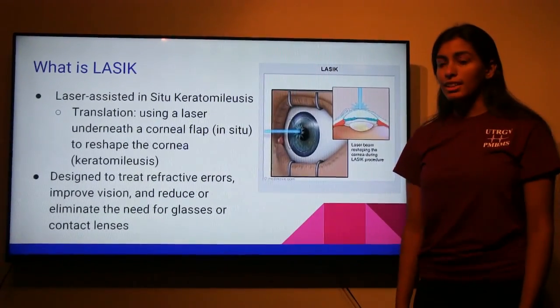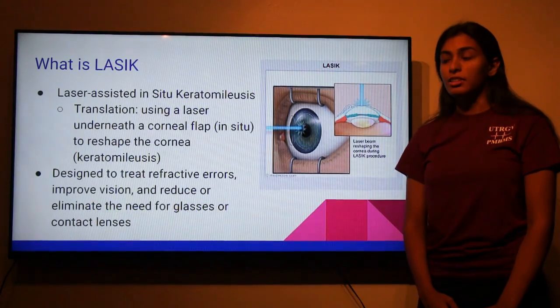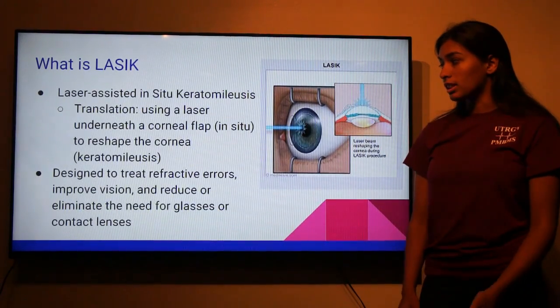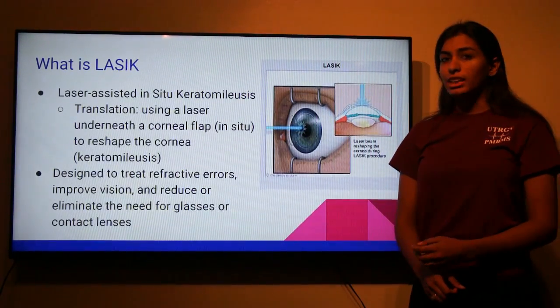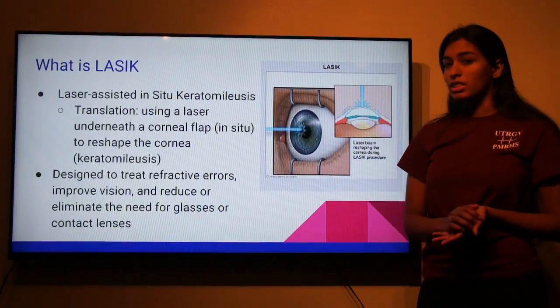So what is LASIK? LASIK stands for Laser Assisted In Situ Keratomileusis. And this translates to using a laser underneath a corneal flap, which is in situ, to reshape the cornea, which is keratomileusis. LASIK is designed to treat refractive errors, improve vision, and reduce or eliminate the need for glasses or contact lenses.